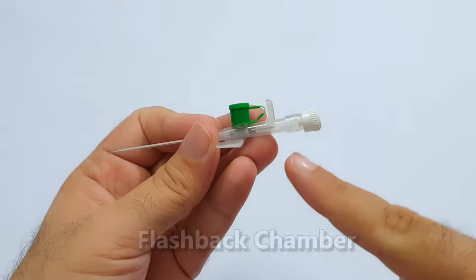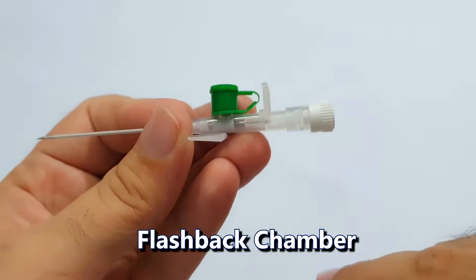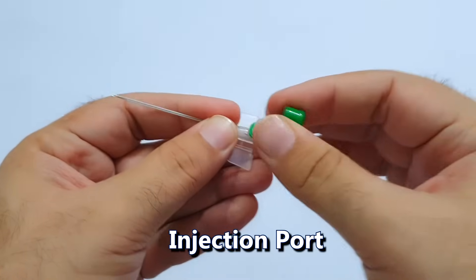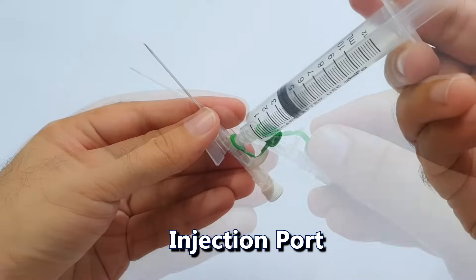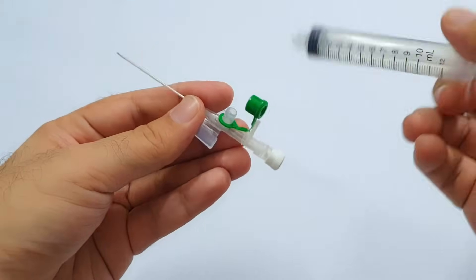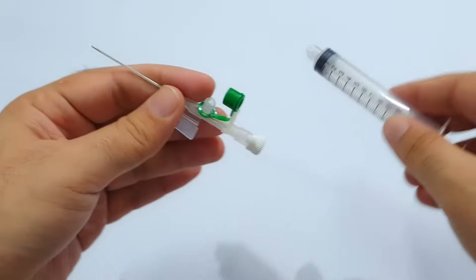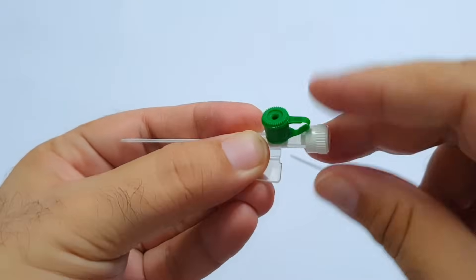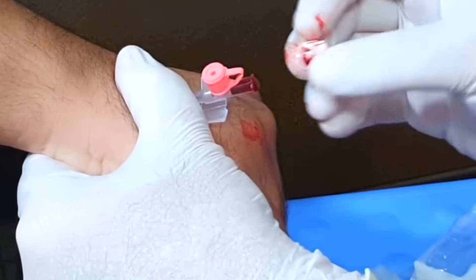This is the flashback chamber — when the needle penetrates a vein, blood flows through the needle and appears in this flashback chamber. This is the injection port from where you can give intravenous injections. Blood cannot flow out of it because it has a valve which prevents backflow. This is its plug — it is used to close the cannula after it is placed inside the vein. If this plug is left open, blood can come out of it because there is no valve here to prevent backflow.